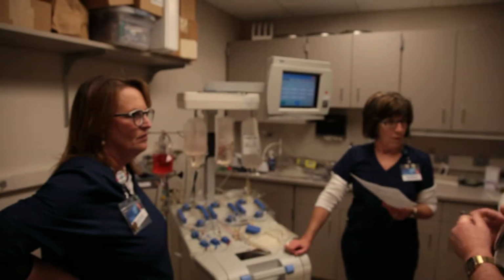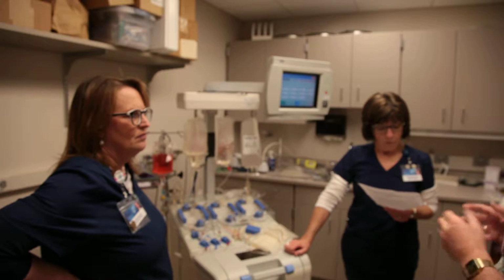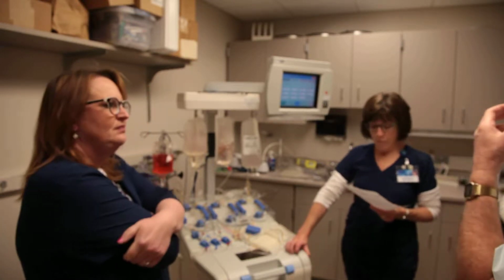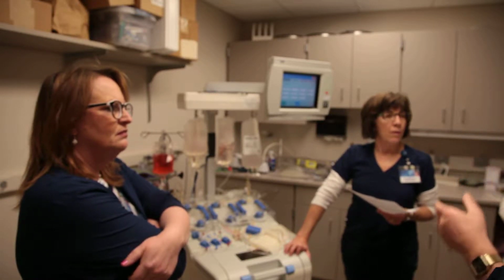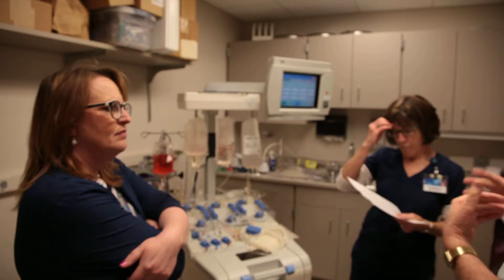...is height, and your hematocrit is what your blood count is. And it's an average, I mean, it could be plus or minus. The trouble is that formula breaks down if you get into smaller children. This machine won't tell you that you can't use it. The other machine will actually tell you.